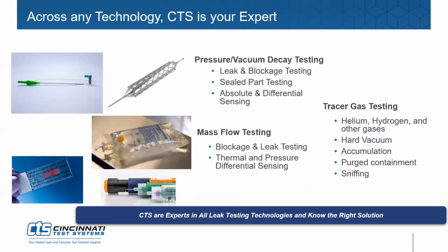In terms of technologies, typical leak testing of devices is primarily based around pressure and vacuum decay. That's the most common by far. We also offer mass flow testing, which in limited cases can be used for leak testing, but in most cases in disposable medical devices is typically limited to blockage testing, restriction or blockage testing.